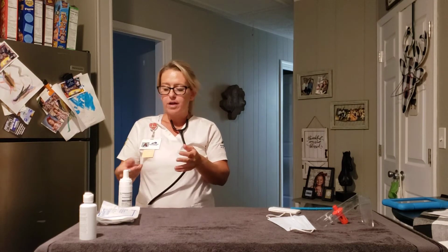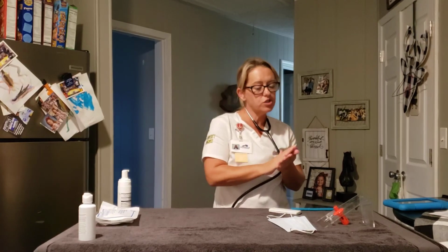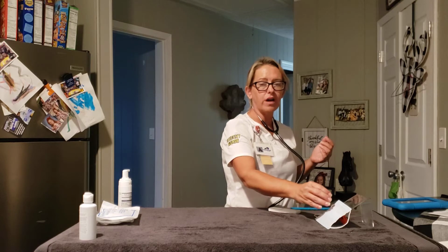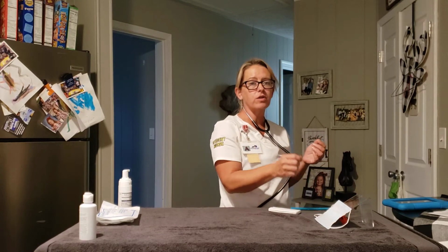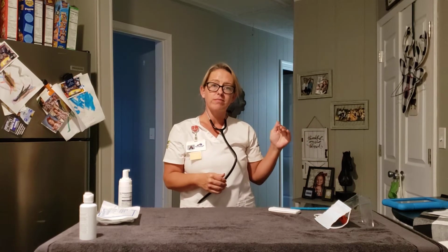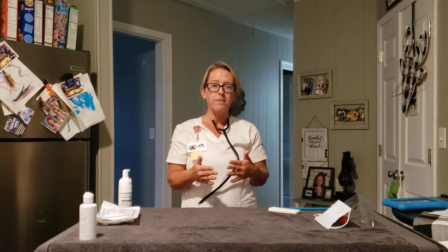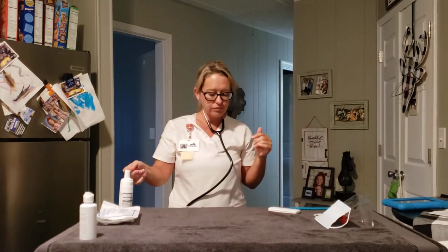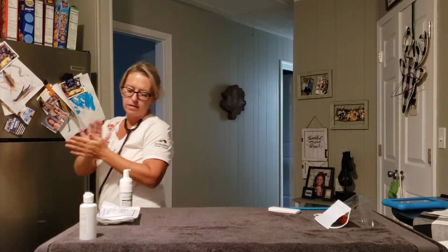Okay, I'm going to go ahead and hyperoxygenate her by placing the mask directly over the trach, and I'm going to turn her oxygen to 100, and I'm going to leave it there for 30 seconds to 3 minutes prior to suctioning. I'm going to also turn the suction between 80 and 120. Wash my hands.